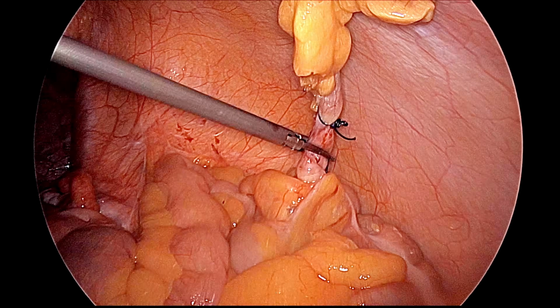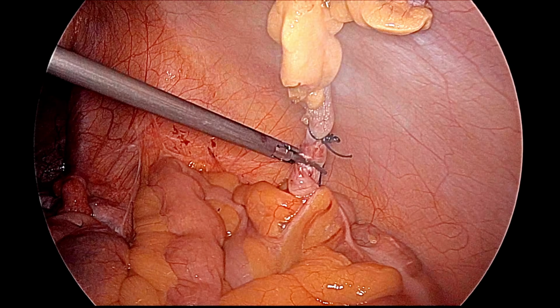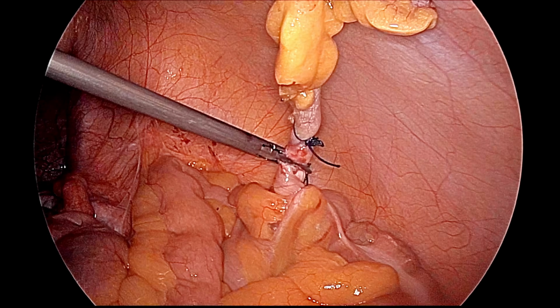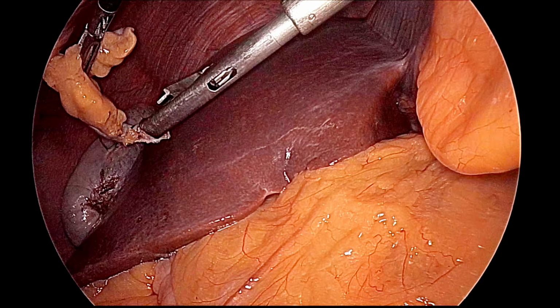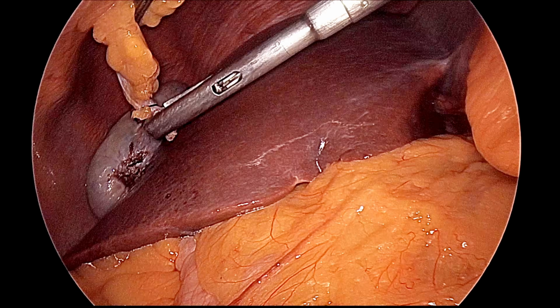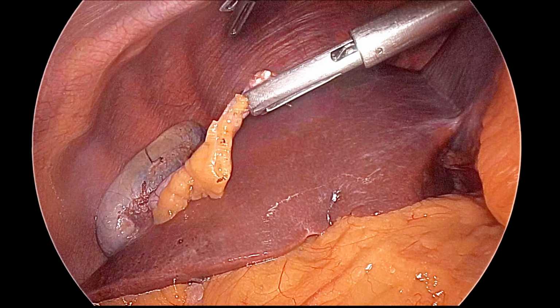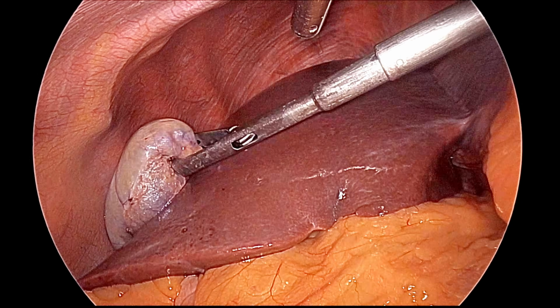Here also we should take care that the harmonic should not cut the suture, and this appendectomy is also done. In front of the knot only 3 to 5 millimeter of stump should be left, and it is over. After that we will take a claw forceps, and with the 10 mm port you should hold the appendix longitudinally. It should not be transverse, and the appendix is removed.